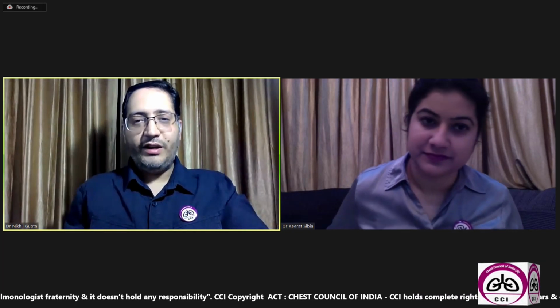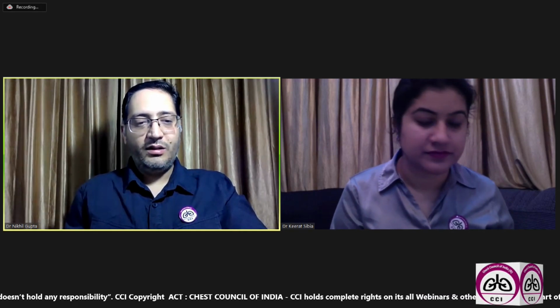So coming to a very specific question, what is the Mach effect? The Mach effect is generally an artifact basically. The left border of the heart is darker in some cases. This is due to technical reasons. So it appears as a sharp black line.